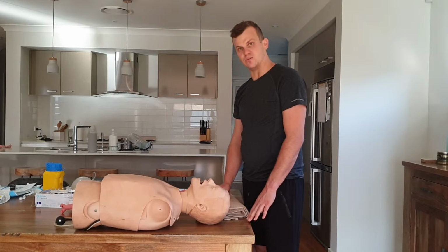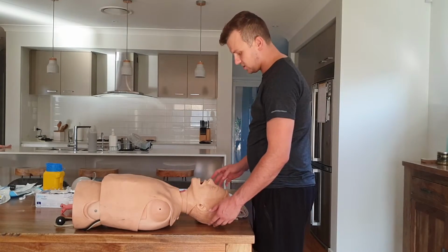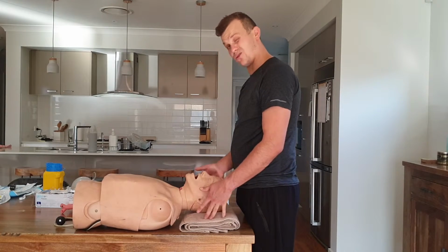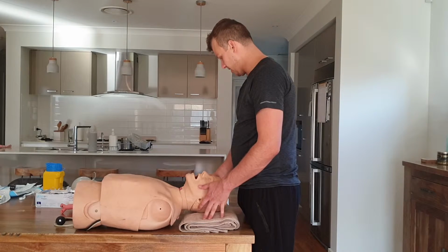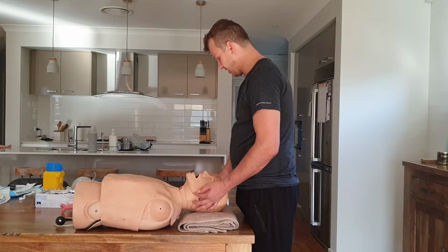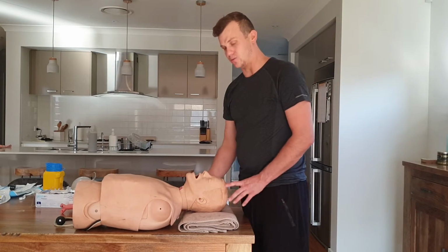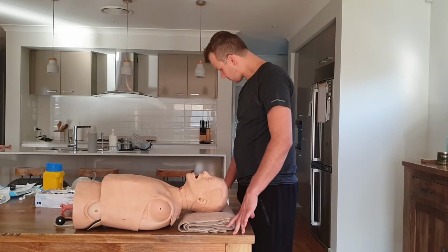So next we're going to move on to positioning. The first position we come across is the sniffing position. This is achieved by placing the towel under the base of the occiput. What we're trying to achieve here is a 30 to 35 degree angle of the lower cervical spine and the upper cervical spine, and a 15 degree forward displacement of the atlanto-occipital joint. With this position, you just have to be careful. If you suspect any C-spine injuries, it should be avoided and you should use manual stabilisation.